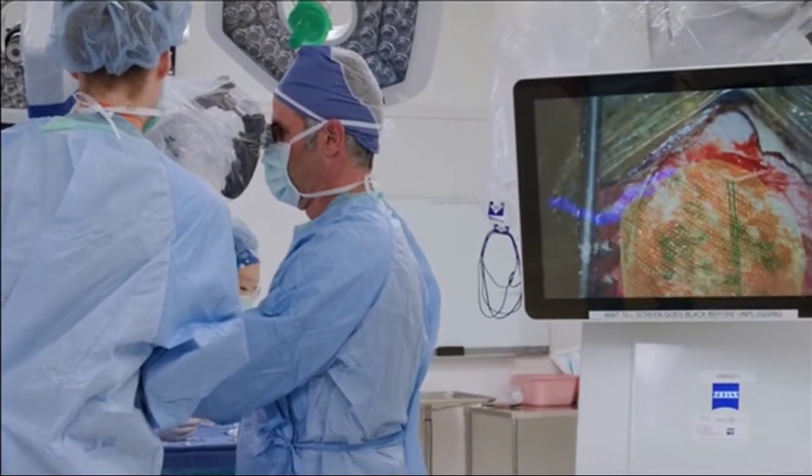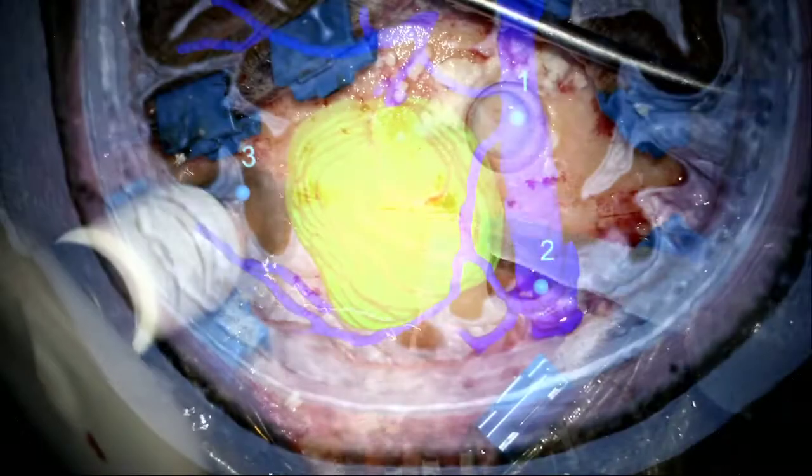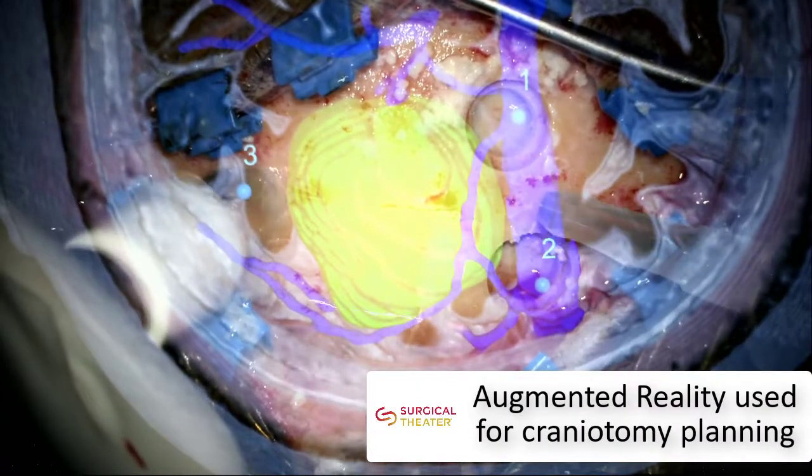Sync-AR is streamlining craniotomy planning by overlaying 360-degree VR objects on the patient's anatomy.